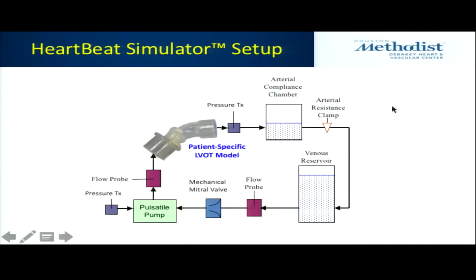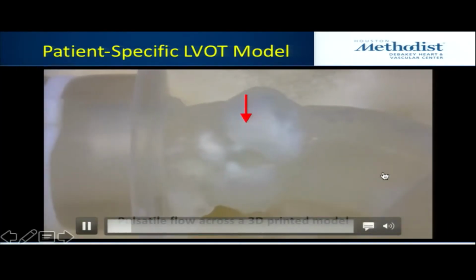So some early work we did was to take these 3D prints and put them in a heartbeat simulator, actually forcing flow through them. This is an example of what that might look like. So that's actually one of our patients.